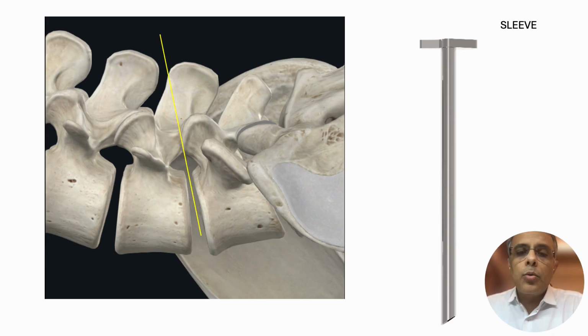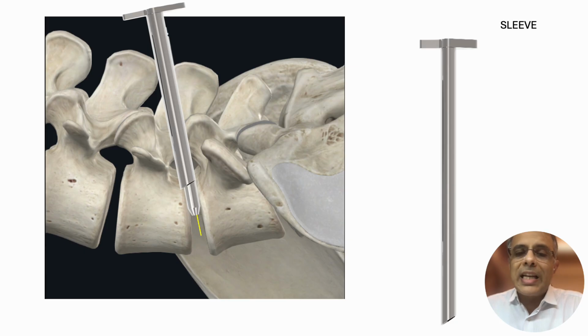Once this is done, you can reinsert your obturator again, and over it the cannula or a sleeve with a beveled end is introduced.